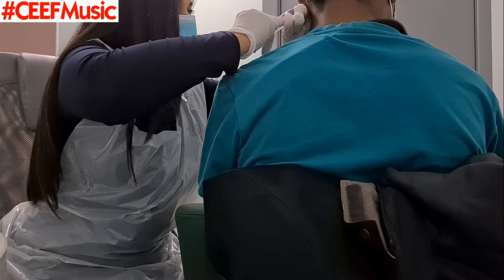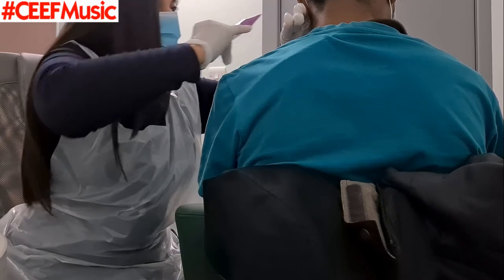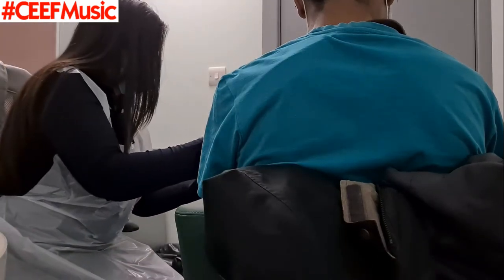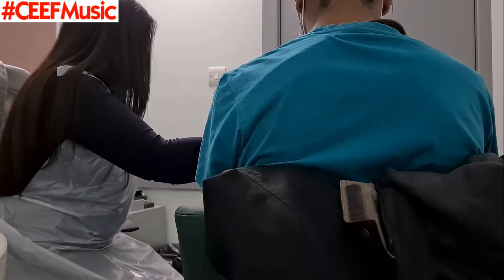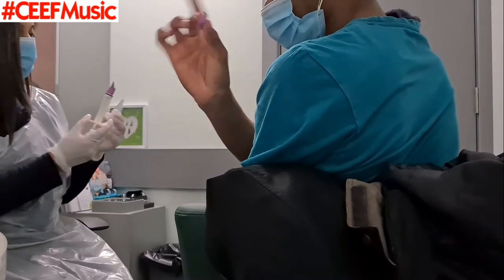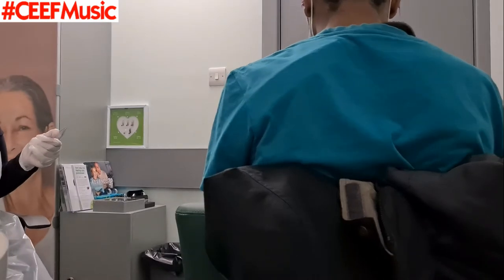At this point, I'll be honest with you — I couldn't hear a blessed thing, because obviously this is designed to travel all the way down the ear canal. And just so you people know, I have very small ears. Like all my life I've had small ears. Even the audiologist said you've got very small ear canals, but don't worry — my ears are healthy. She even confirmed my ear canals are healthy.